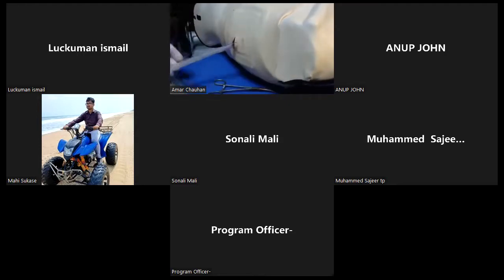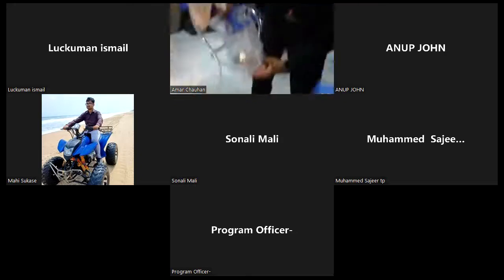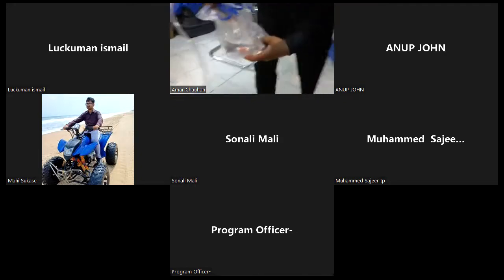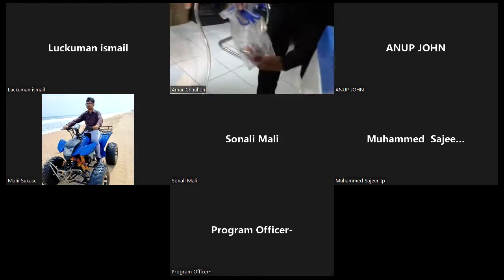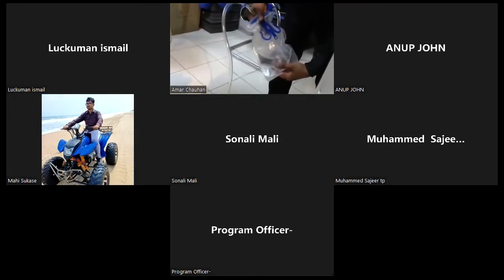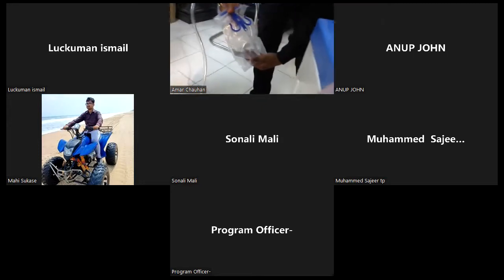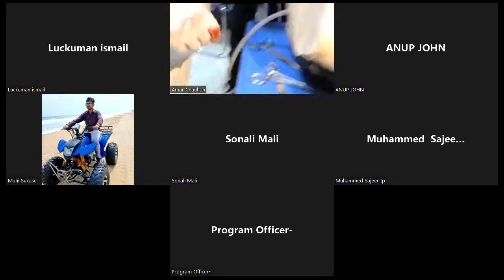Now connect to underwater drainage. And now this is the tension pneumothorax, that was the scenario. And you can see the bubbling. Just show that. Okay, so that was ICD.